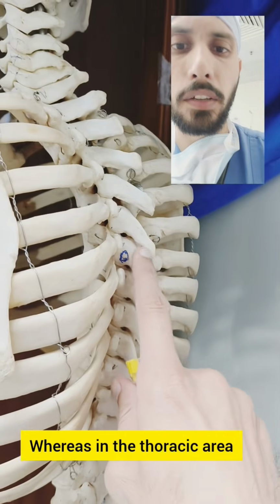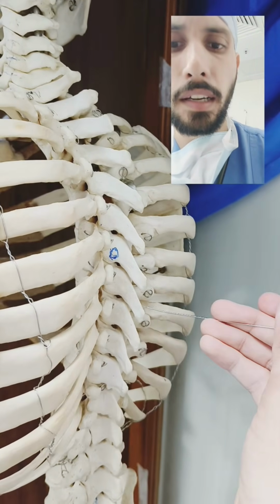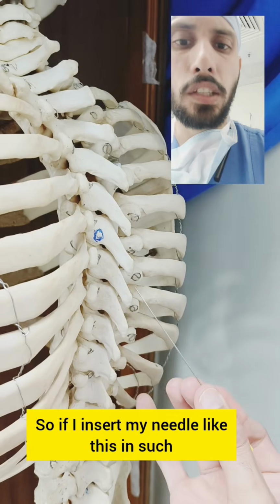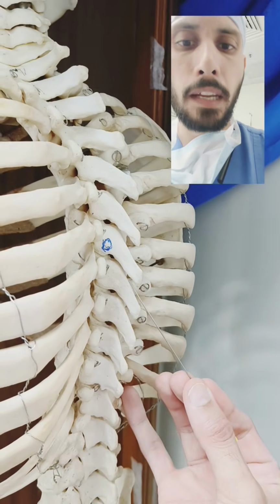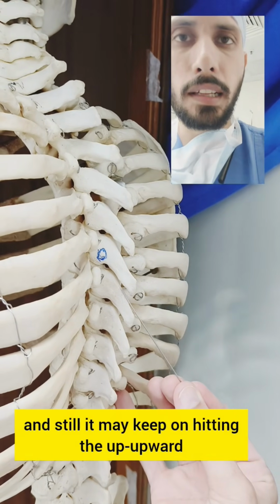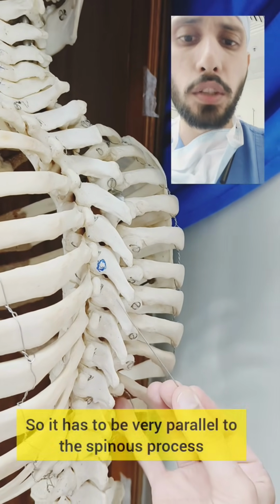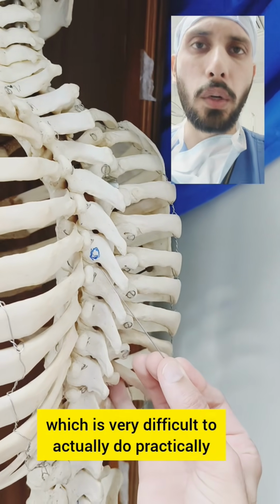Whereas in the thoracic area, you can see that the spinous processes are pointing downwards. So if I insert my needle, it will keep on hitting either this spinous process or the one above. If I insert my needle in such a cephalad direction, then only is there a possibility that it will go like this. Even then, suppose you have inserted a bit inside, it may still keep on hitting the upward surface of the spinous process below, or it may hit the under surface of the spinous process above. So it has to be very parallel to these spinous processes, which is very difficult to actually do practically.